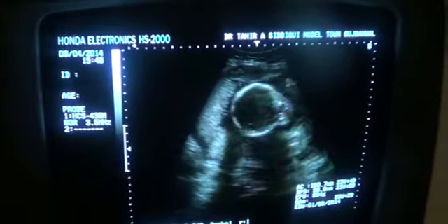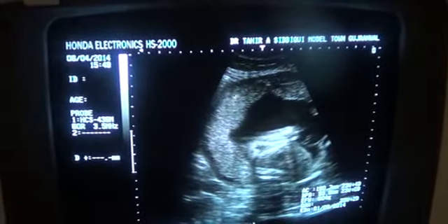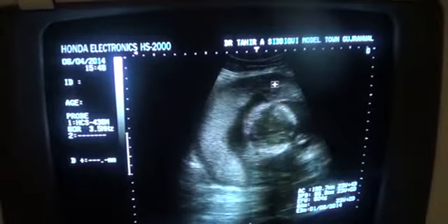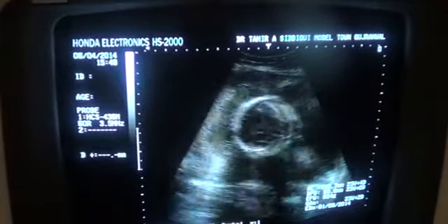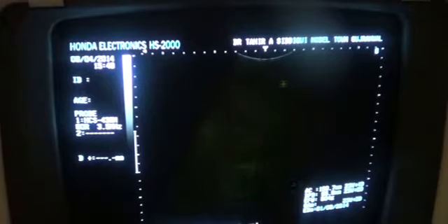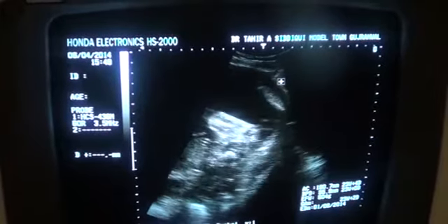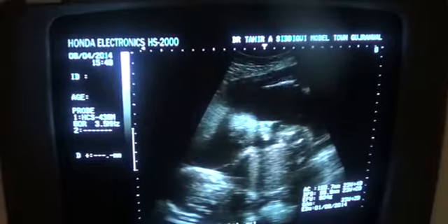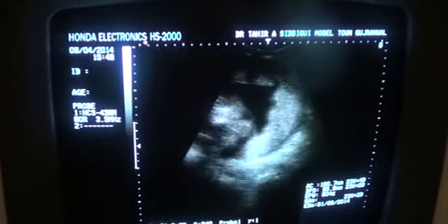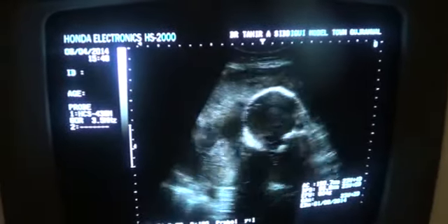This is an obstetric scan, and you are seeing that the placenta is fundal and grade 2. Now when I come down, towards the urinary bladder, this is the urinary bladder, and here, so fundal region, placenta grade 2.